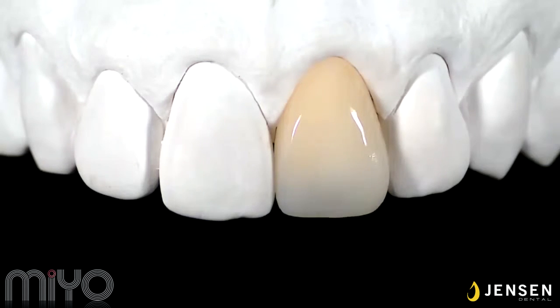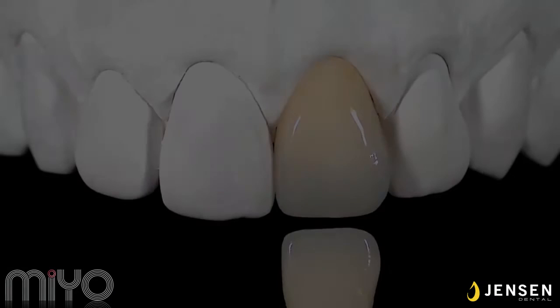It's not about the intensity of the colors. Instead, it's all about contrast. Always think contrast when working with MiYO on your monolithic restoration. As you can see here, I dabbed the color to a nice gradient of a transition, creating an initial canvas before all the effects are applied. Check my target value once again in all angles.